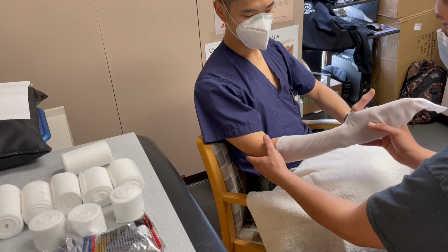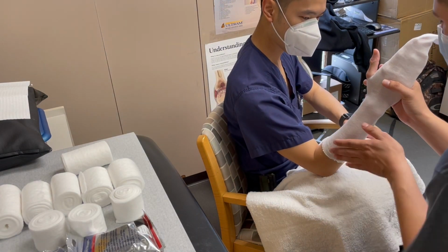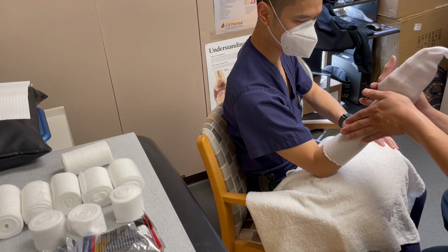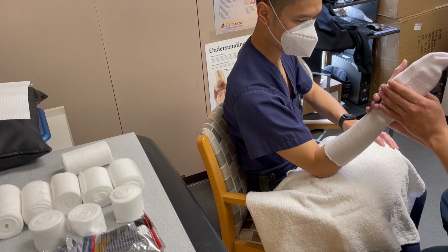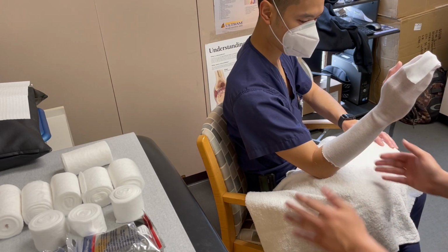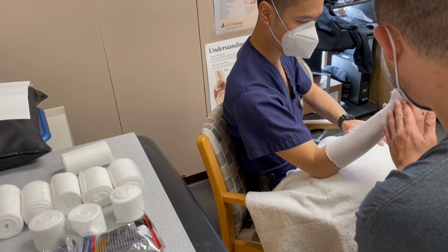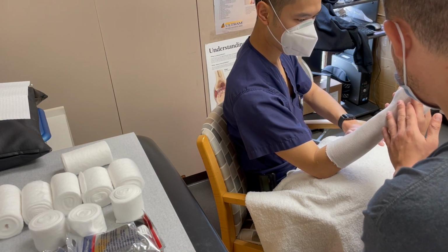You then want to have the arm in the desired position in order to start the cast. The short arm cast should start from the distal palm or crease and extend to the forearm's proximal third. The wrist should be in a neutral position and slightly extended. Remember to watch for radial or ulnar deviation.